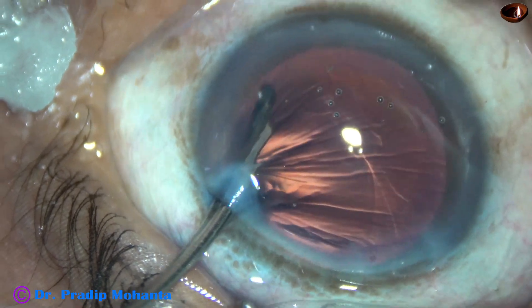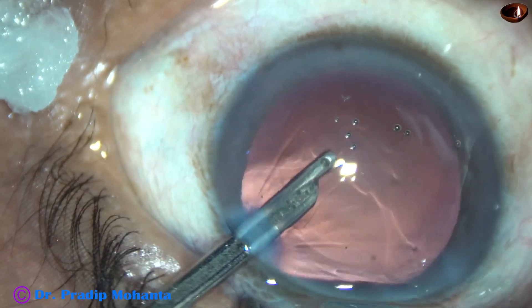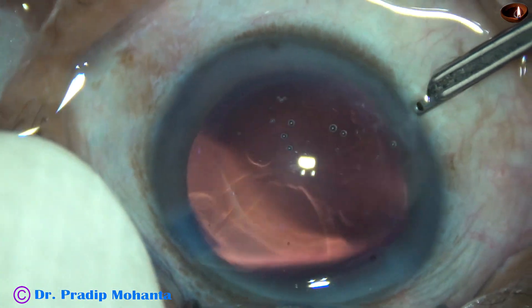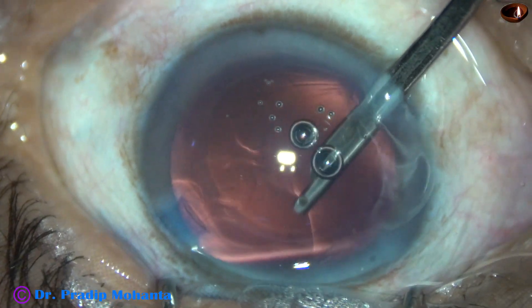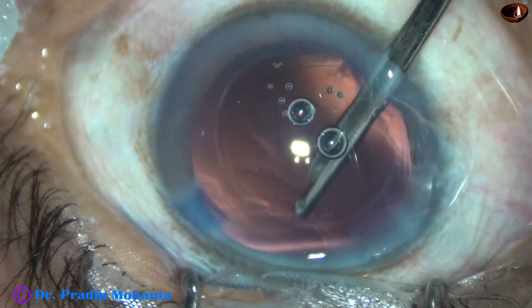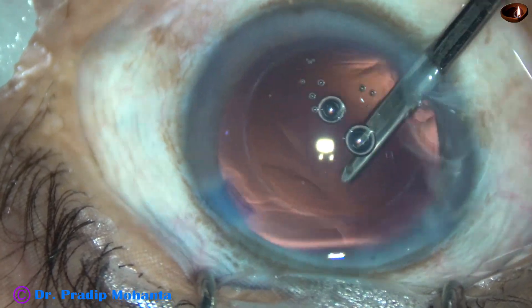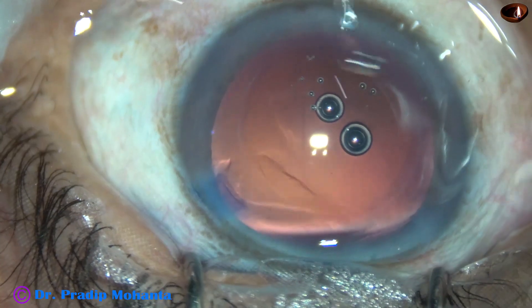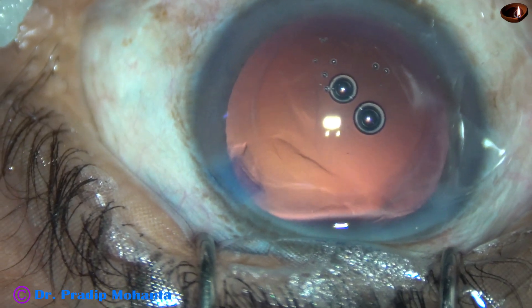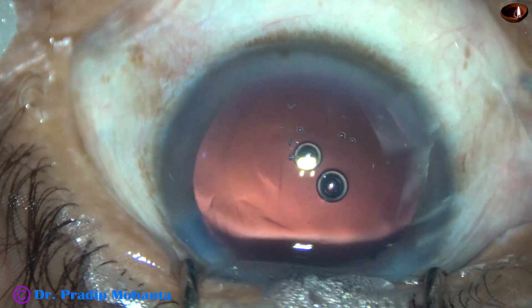The side ports are about 1.6 to 1.7 mm in size and are 90 degrees away from the main incision. These slightly larger side ports neutralize the astigmatism produced by the main incision to some extent.